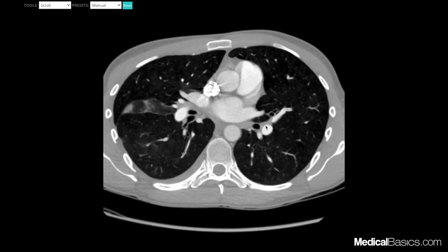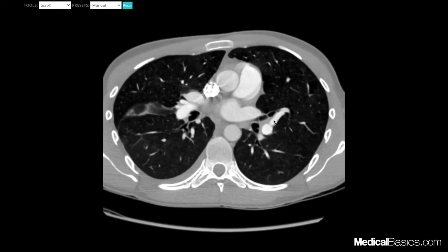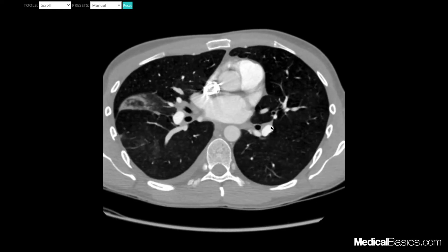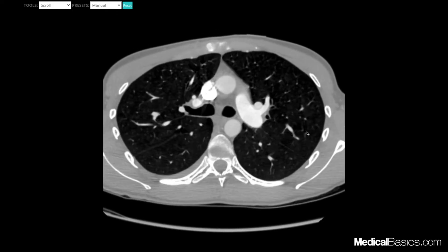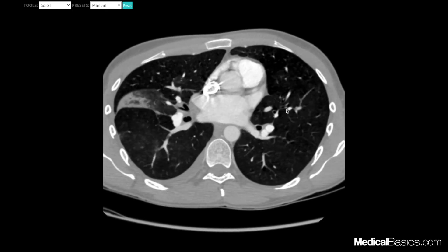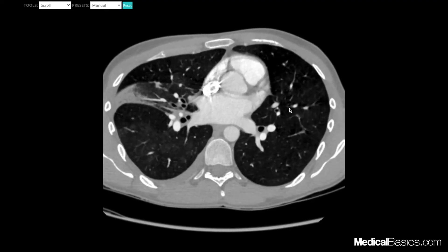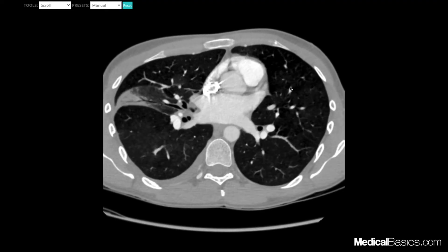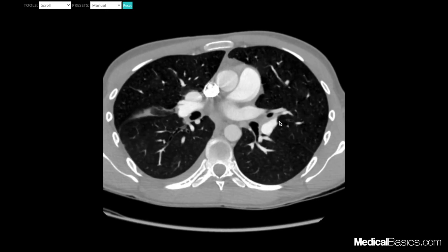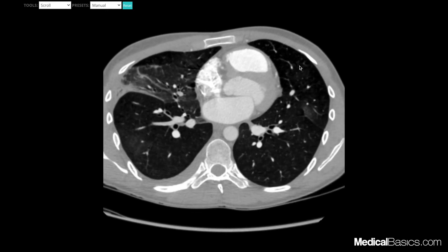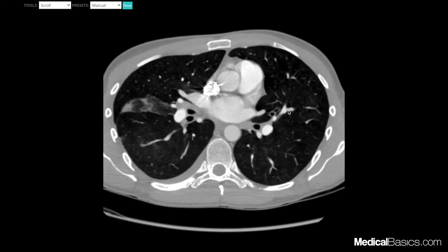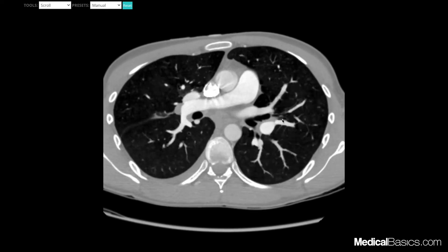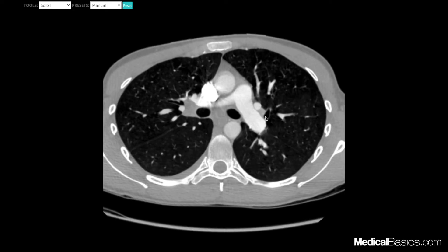For the lingular branch, we see two arteries coming off heading toward the lingula. Scrolling up shows one going superiorly — that's our superior lingular branch — and scrolling down shows the other going inferiorly with multiple sub-branches — that's our inferior lingular branch. You continue to follow each branch out to the end. That's what our lingular branch looks like.